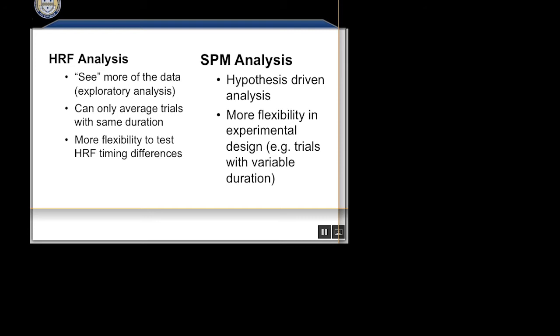If that was the case, your hypothesis is, did this population differ from that one, or did this condition differ from that one? And for that test, by choosing the window, as long as you were consistent between the two, you're fine. You don't have that bias. It's really if you're testing, did this condition activate relative to a baseline? That's where you run into the bias, right? Or if you looked at the two conditions separately and said, I'm going to use this window and I'm going to use that window. That's a problem, right?